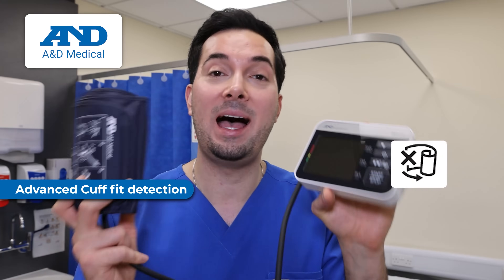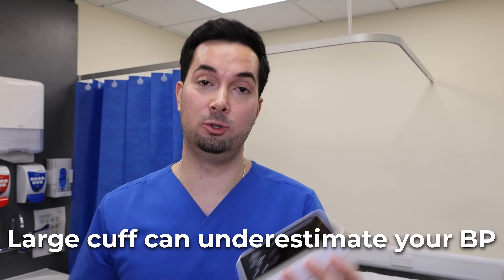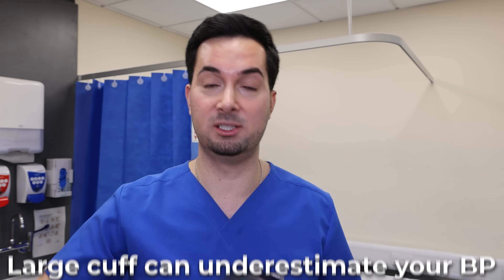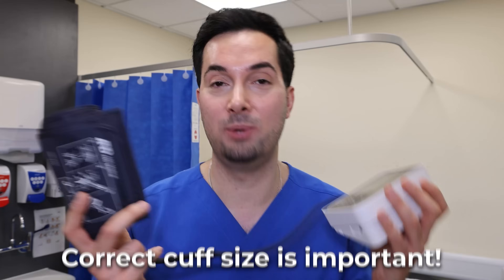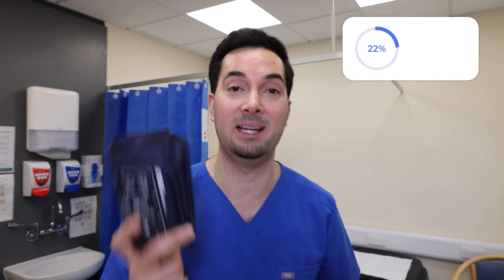Many A&D Medical blood pressure monitors come equipped with advanced cuff detection and movement detection to ensure reliable results. To consider the flip side: if his cuff had been too big, it would have underestimated his blood pressure, meaning his actual blood pressure might be higher than detected and he might not have received the correct treatment or diagnosis. Cuff size is so important, and we're going to go through everything you need to ensure your cuff size is right and you're getting accurate readings.